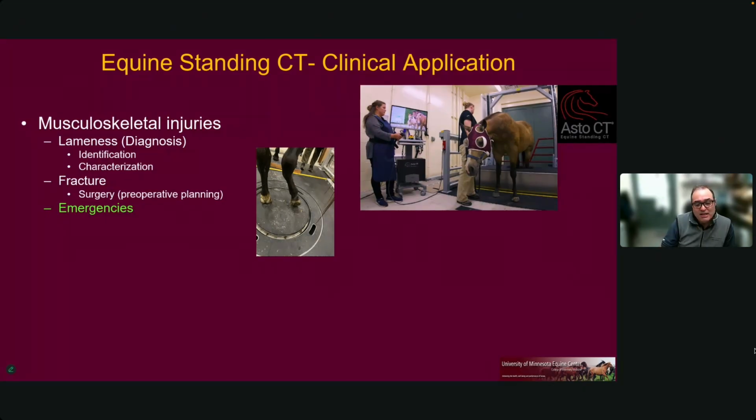That's another plus. One of the, I would say, collateral damages, and I say damages because I am not a big fan of dental diseases. I don't do a lot of dentistry, but the quality of image that you get with a CT compared to X-rays in the skull area was a pretty big plus when it came to the horse itself, and having a good diagnostic technique in order to diagnose all these dental and skull issues. The CT has been quite effective for that area.